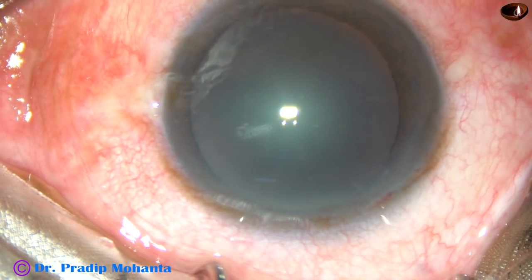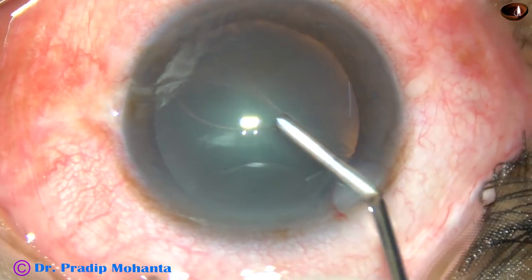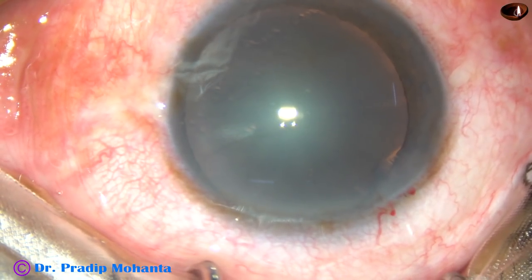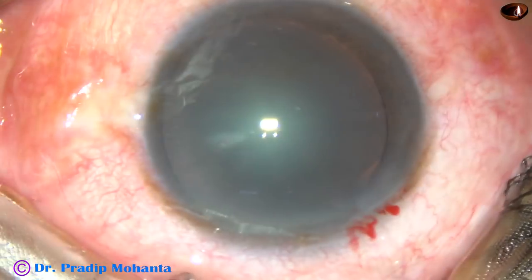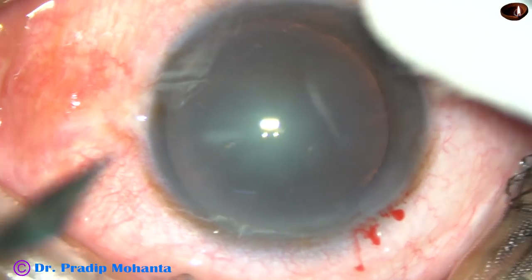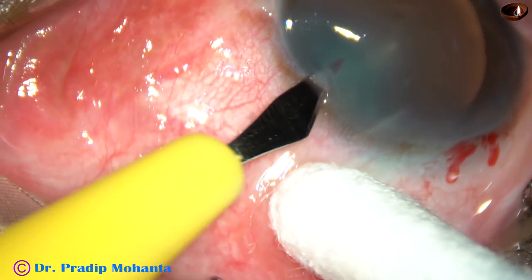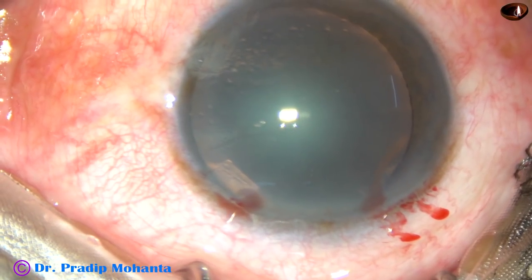By this time, the main incision has been made. Now, this is 2% hydroxypropylmethylcellulose filling off the anterior chamber. And now, in this case, I am going to make only one side port on the left side.